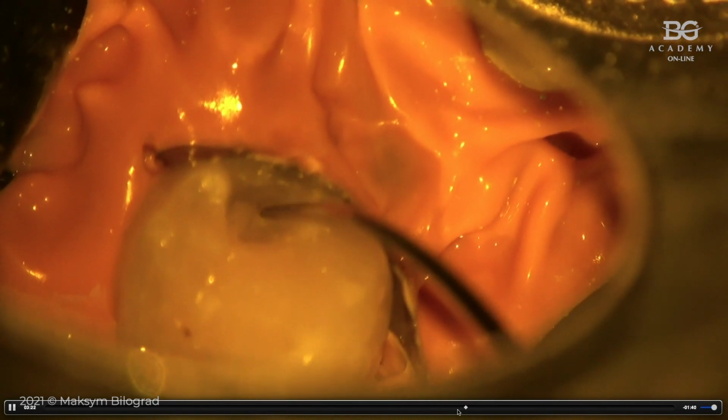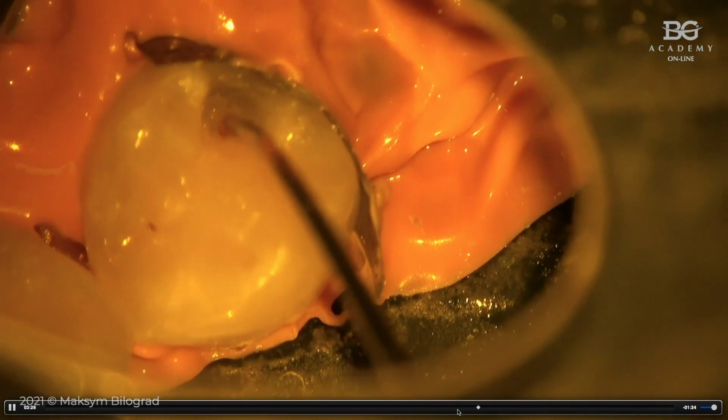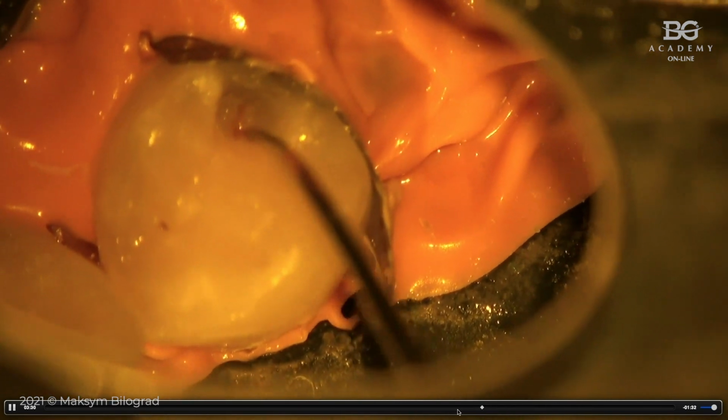This case, by the way, was done in 2013, and I was experimenting actually with composite techniques. I used multiple layers and tried to sculpt the dentine. Also, I used tints. Nowadays, I don't use tints a lot.